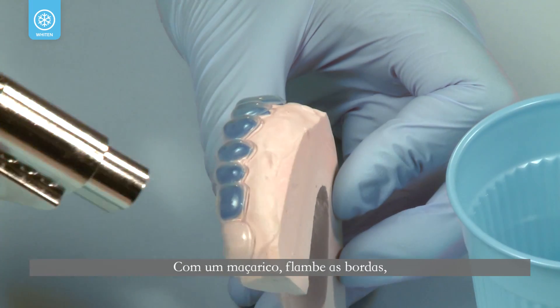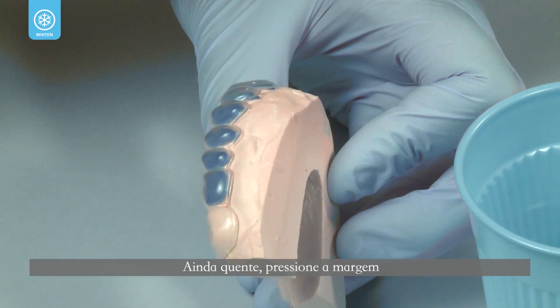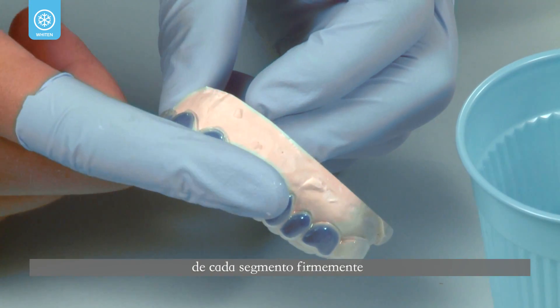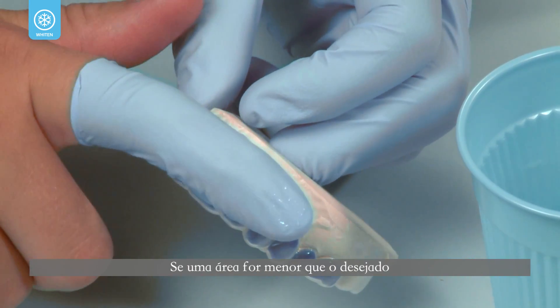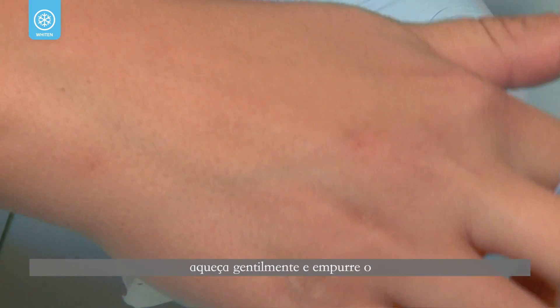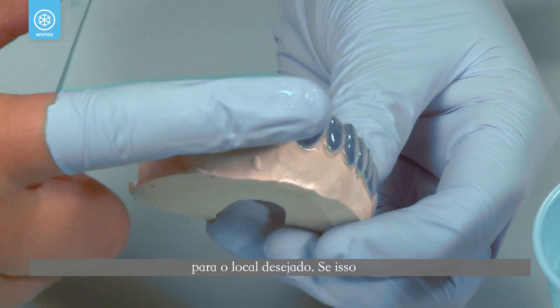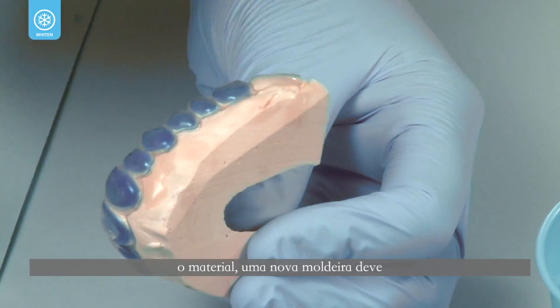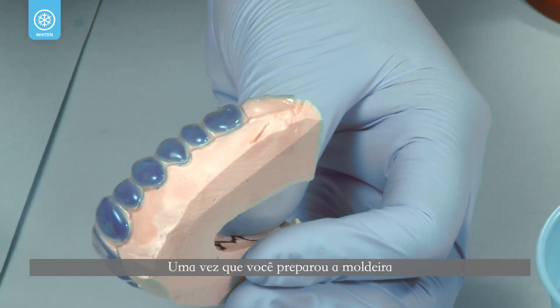Gently flame polish the edges one quadrant at a time. While still warm, hold the periphery of each segment firmly against the model for three seconds with a water-moistened finger. If an area is short of the desired length, gently heat it and push the tray material to the desired location. If this overthins the tray material, a new tray should be fabricated.